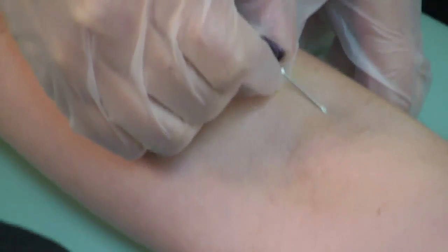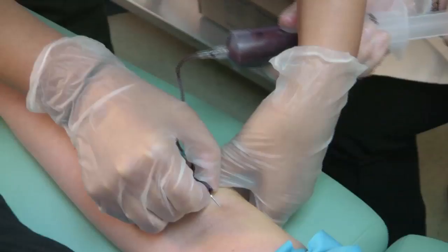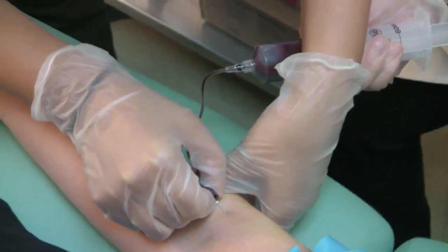The medical assistant is withdrawing blood from the patient's arm. You can see the syringe that the blood is being withdrawn into.